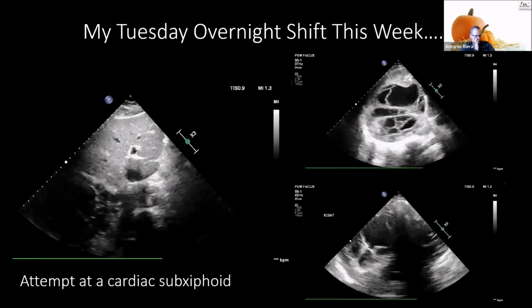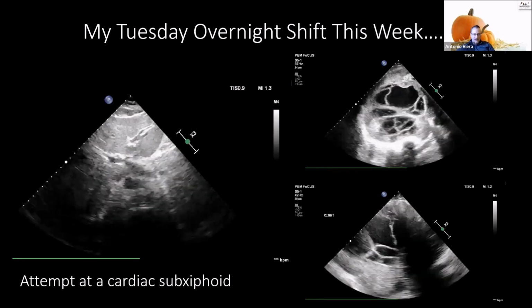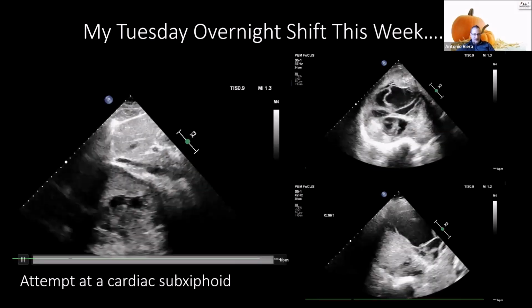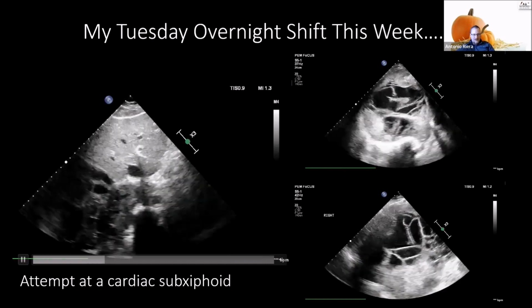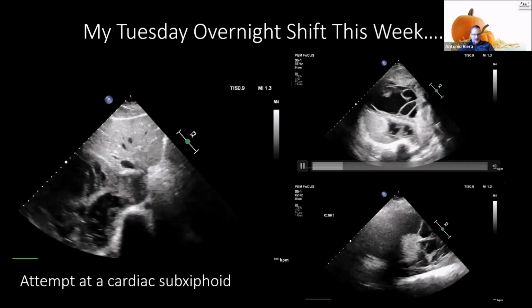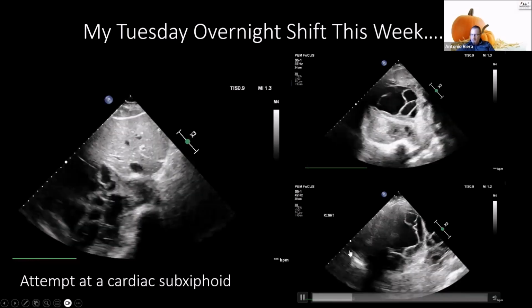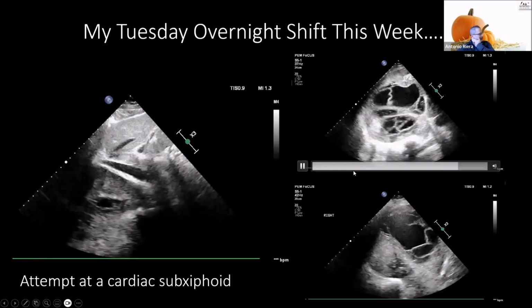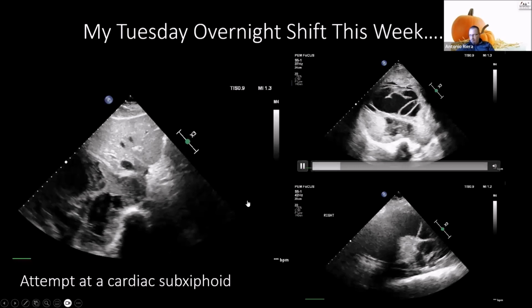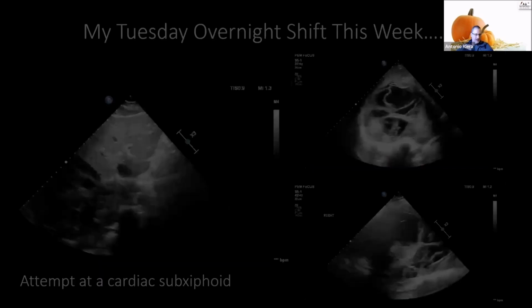And so I started doing cardiac evaluation, and I had a very tough time getting a good apical 4. And as I tried to do the subxiphoid view, I saw this, and I said, well, I'm clearly imaging the wrong organ here. And with the phased array probe on the cardiac setting, this was the large loculated effusion that on follow-up CAT scan was more consistent with relapse and progression of his metastatic disease. But he had fever, so we gave him antibiotics, and this just happened, so he's admitted to the hospital.